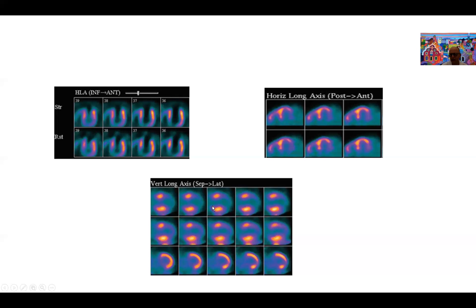However, if you go down to the bottom images, you can see there's very mild reversibility in the apex of the left ventricle. The LAD territory is actually a reflection of marked evidence of hibernation as you can see on the FDG images. So despite having probably less than 50% perfusion in the apex, you're ending up with significant amount of hibernation as depicted on the FDG images.